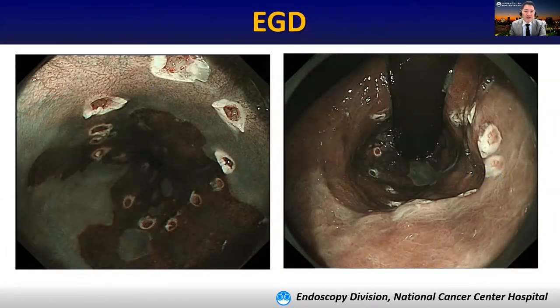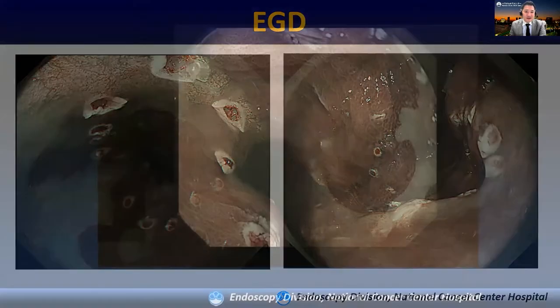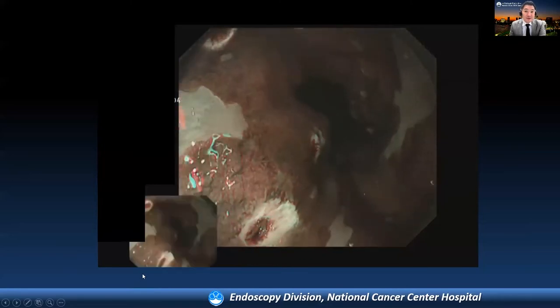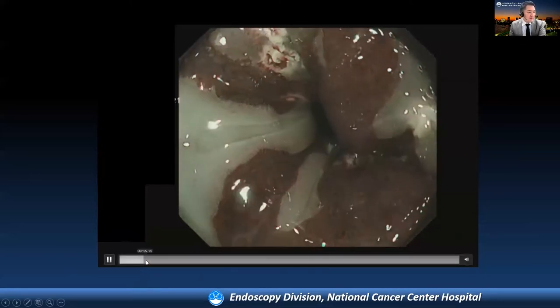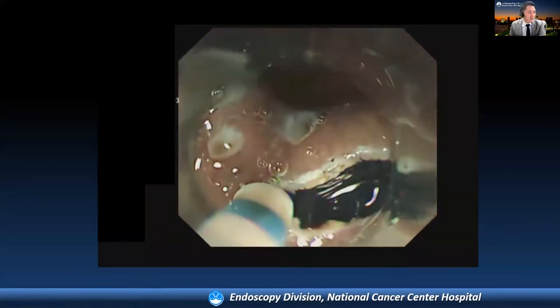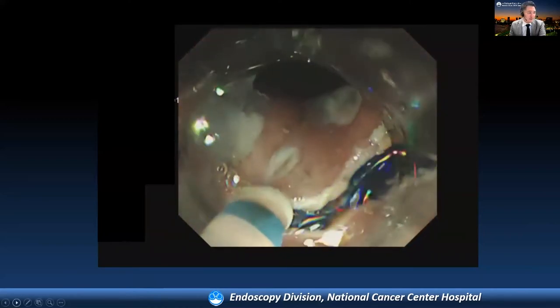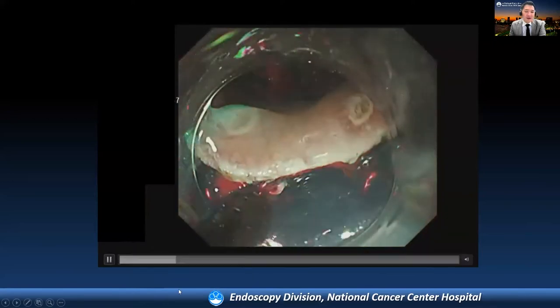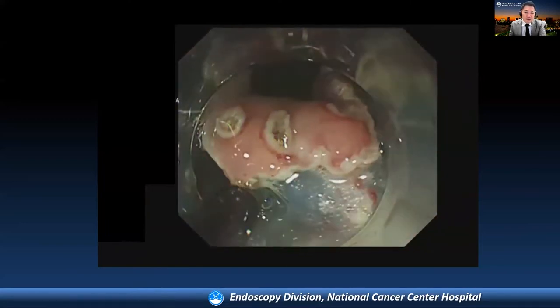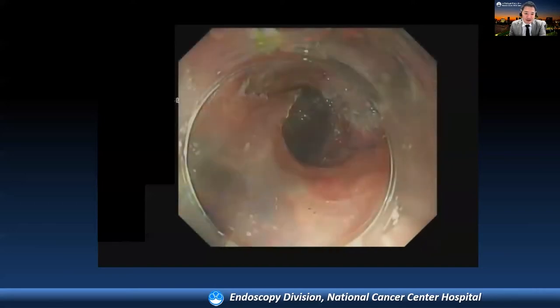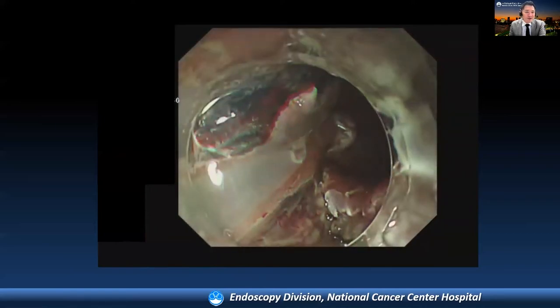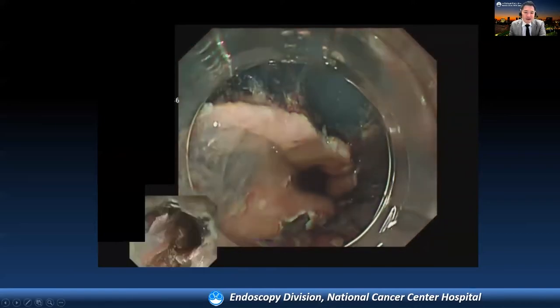We performed wide marking around the lesion and performed extensive ESD. Here you can see the endoscopic marking outside the two lesions. Mucosal incision was performed using the dual knife J in retroflexion. The following procedure is submucosal dissection using the IT knife nano, performed parallel to the muscle layer. After circumferential mucosal incision and trimming, the edge of the submucosal dissection plane shifted as the lesion shifted distally.